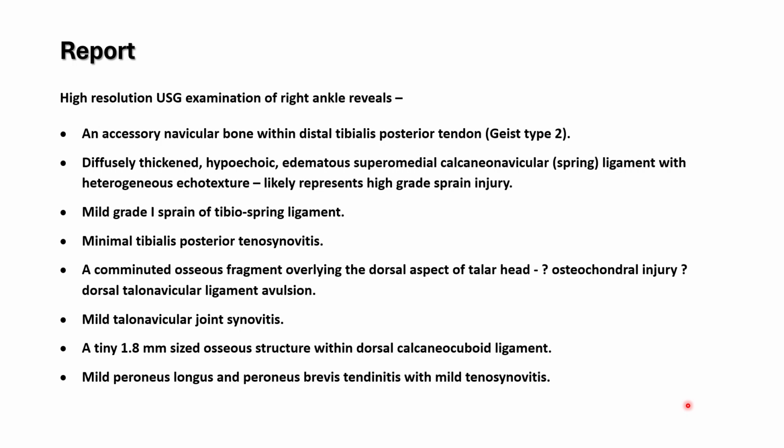So overall, high-resolution ultrasound can provide various details of the soft tissue injuries, as well as details about the cortex, and if there are any small fractures or small avulsions, those can also be very nicely picked up on ultrasound.